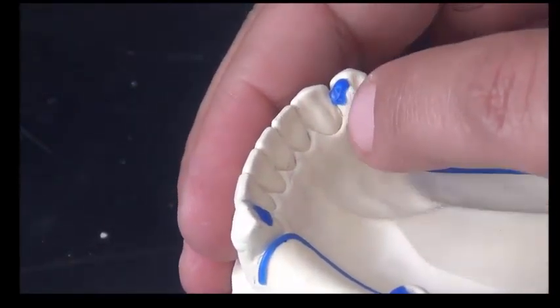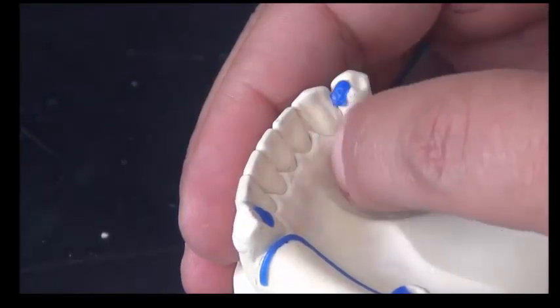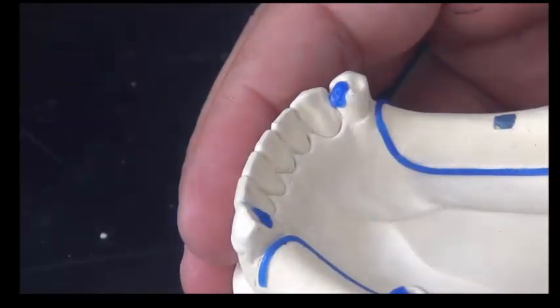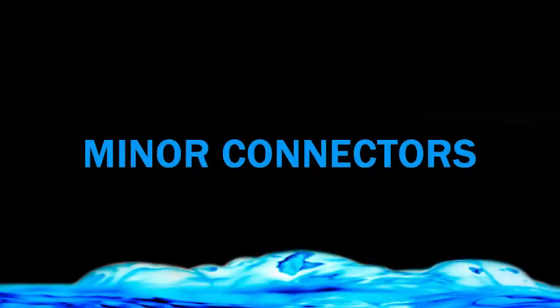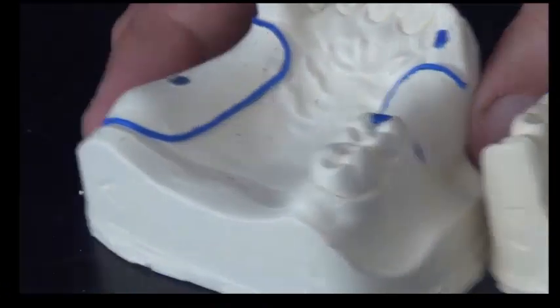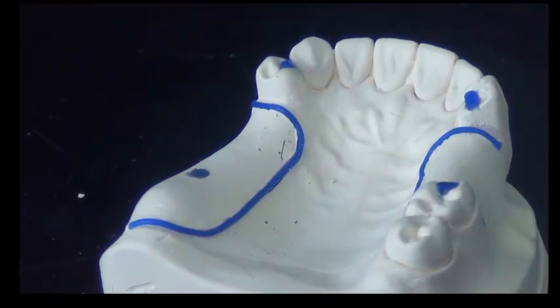So once more we add enough thickness and we make it run from the proximal surface into the embrasure in between teeth, not on the saddle area. Now we're ready to do our next step. The next step after this is adding minor connectors. We have multiple minor connectors and we're going to explain one by one.